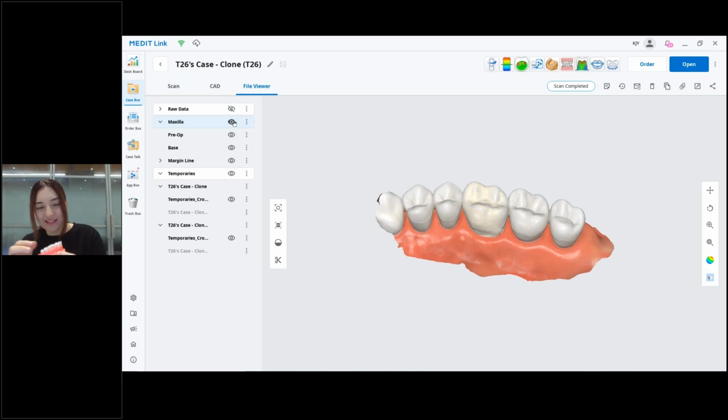Personally, it's amazing for me that I can print out a model in Model Builder, and then I can print a crown and put it in that model. Because digital scanning is something that is inside your monitor, so it's not something that you can actually see or hold in your hands, right? And this is really exciting. Having Model Builder and Temporaries together is just taking it full circle. That's really, really exciting. You guys, I know you've been so busy. Very cool.